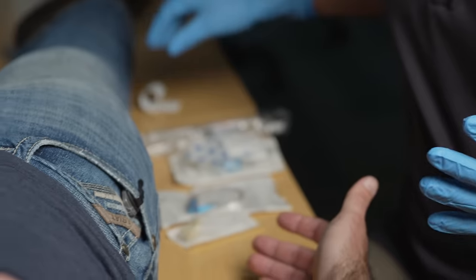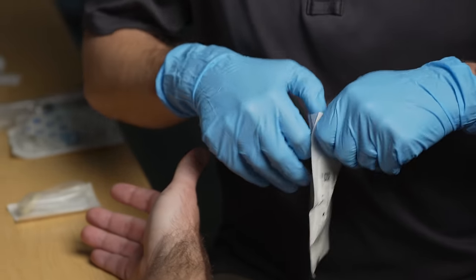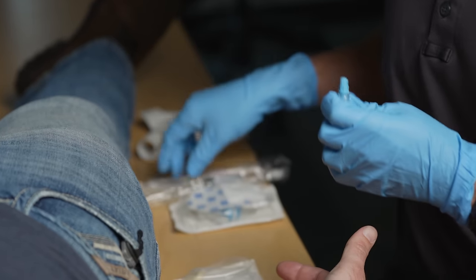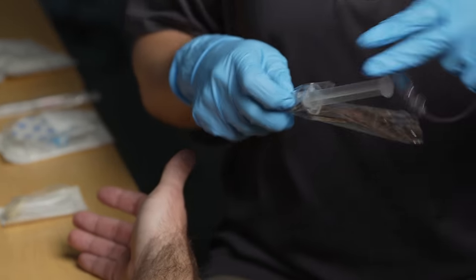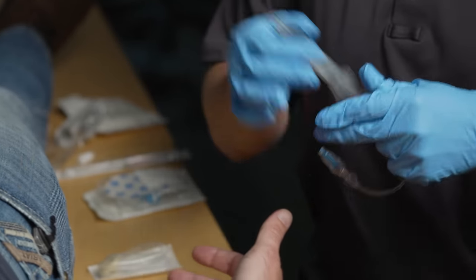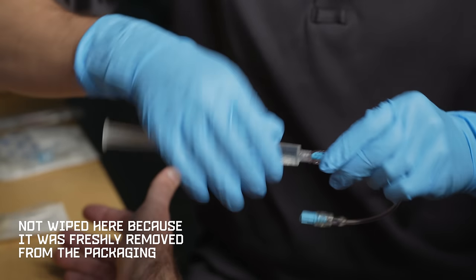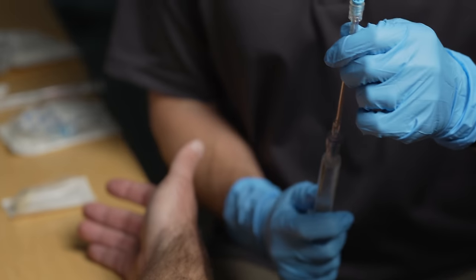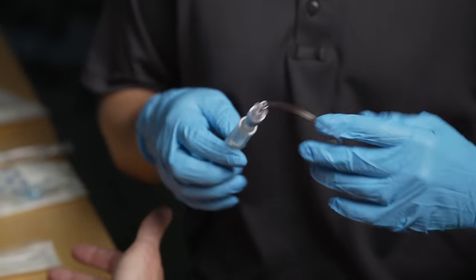Once your gloves are on, I'm going to start opening up some of the kit. I like getting out the J-loop and making sure it is flushed and ready to go first. I'm also going to get the saline flush ready — technically you should be wiping the end of this luer lock with an alcohol wipe prior to using it. So we fill that up and now I'm going to set that aside.